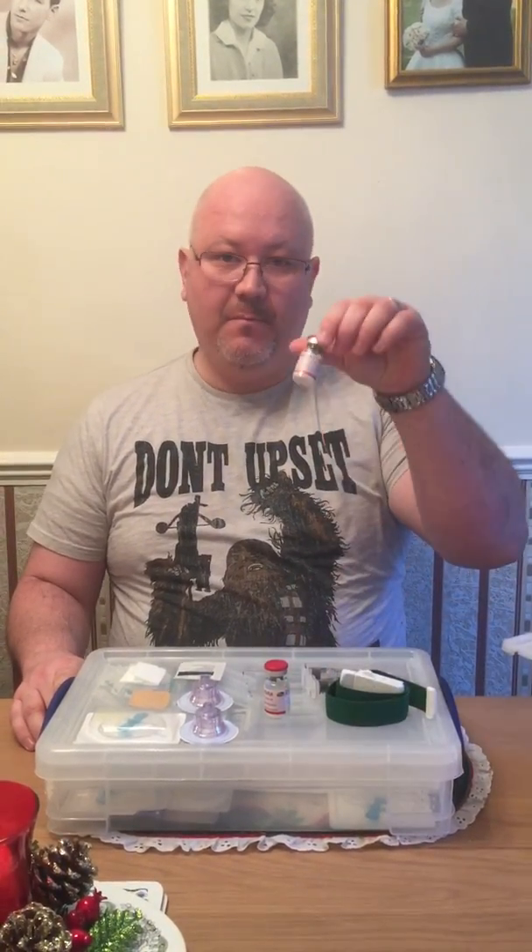Monday 2nd of January 2017. About to do my last ever injection of Benefix, which is a recombinant clotting factor 9 for Haemophilia B. The reason it's my last ever is because on Wednesday I'm going to be having a new clotting factor, which is an extended half-life version.